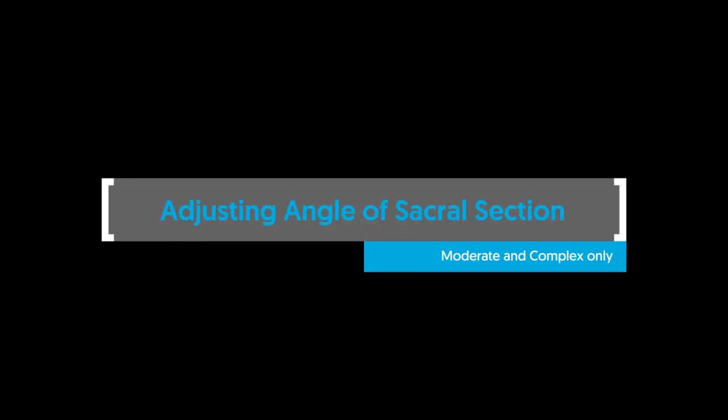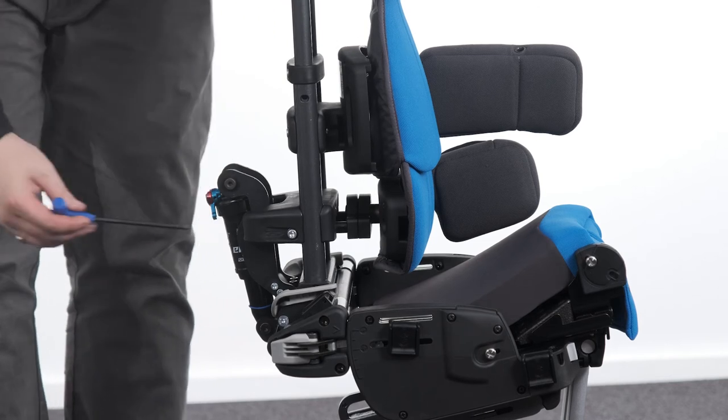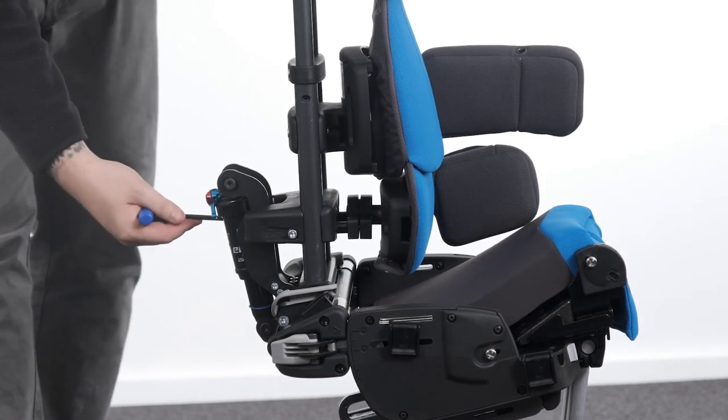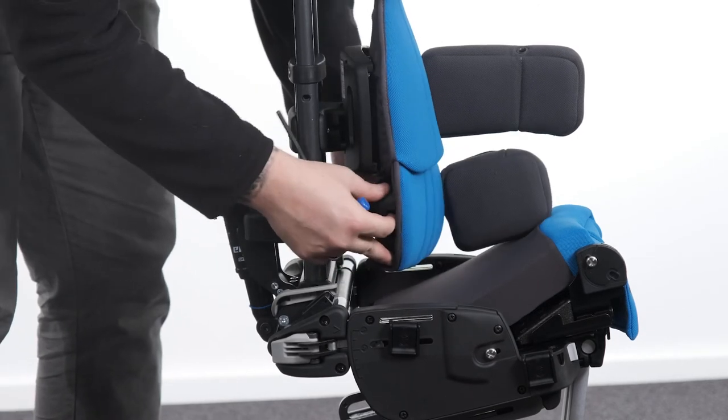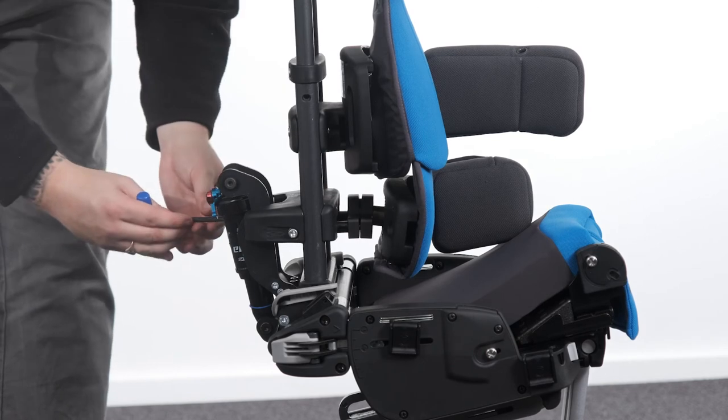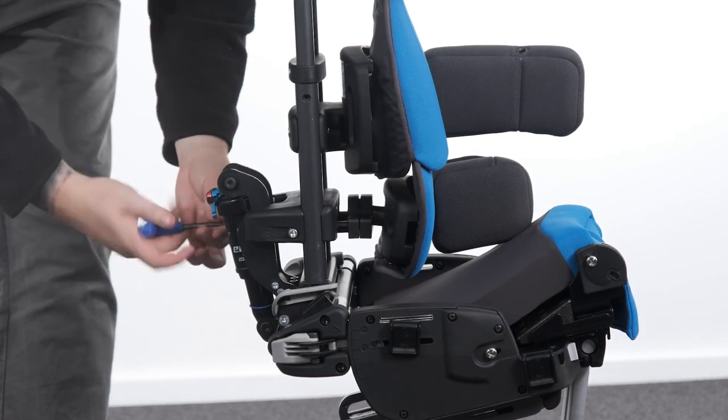Adjusting angle of sacral section — moderate and complex only. To adjust the angle of the complex clamp, loosen the bolts of the clamp. Adjust the angle by rotating the backrest section in all axes to the desired position. Tighten the bolts to secure in place.